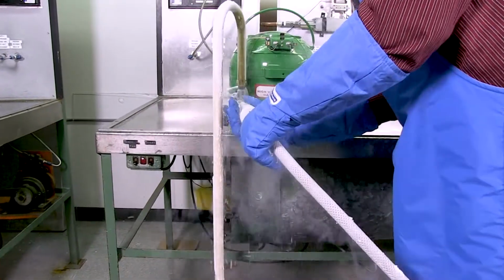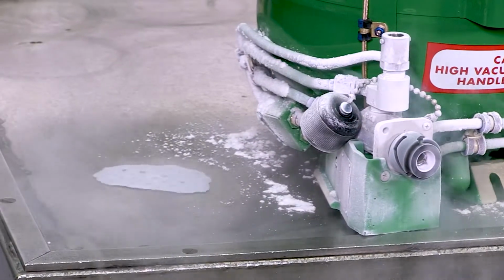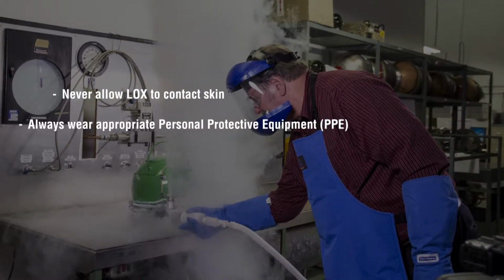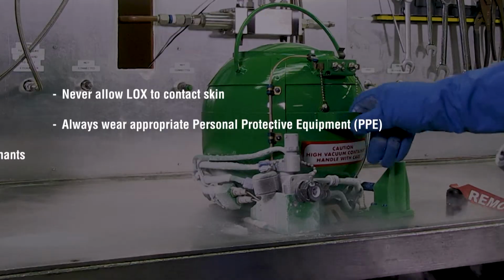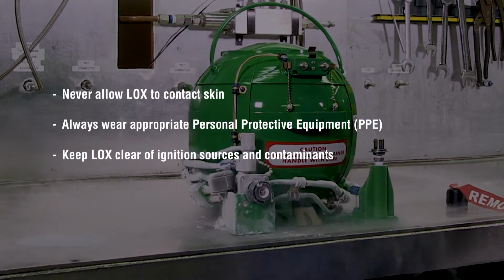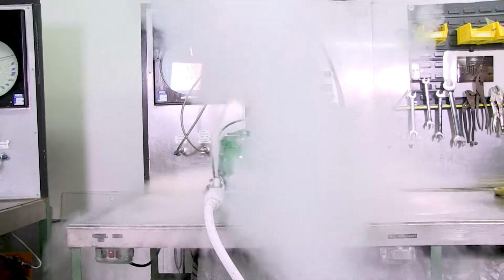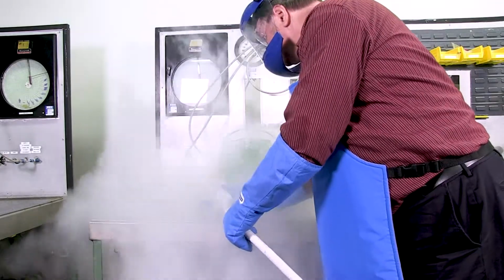Before beginning any of the following procedures, take time to become familiar with the risks associated with liquid oxygen. Never allow LOX to contact skin. Always wear appropriate personal protective equipment, also known as PPE. Be sure to keep LOX clear of ignition sources and contaminants. Never transfer LOX on asphalt. For more details on LOX precautions, handling, hazards, and properties, refer to your operator's manual.